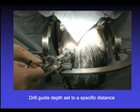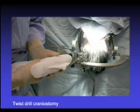The skin is infiltrated with lidocaine. The skin puncture device is used to core through the skin and anchor onto the outer table of the skull. The 4 millimeter drill bit is then placed on the skull and the depth guide set to a distance of 6 or 6.5 millimeters. Using the twist drill, the craniostomy is then created.